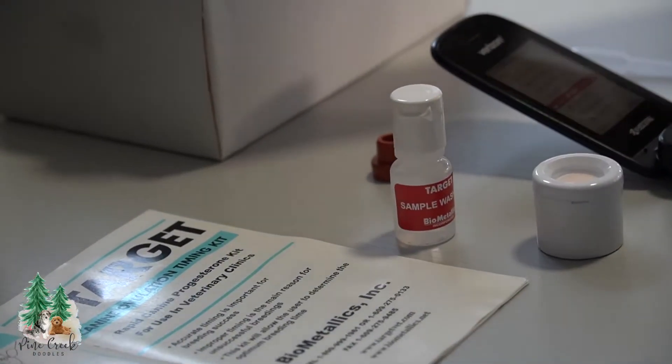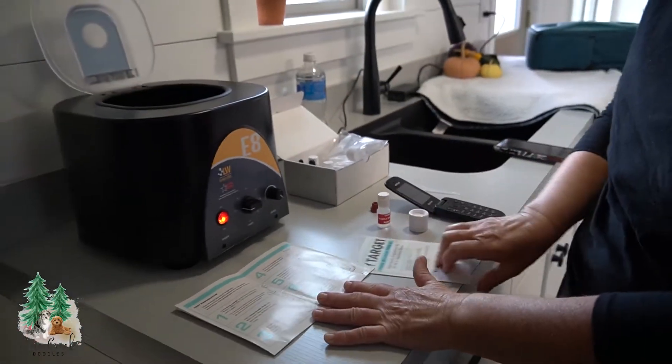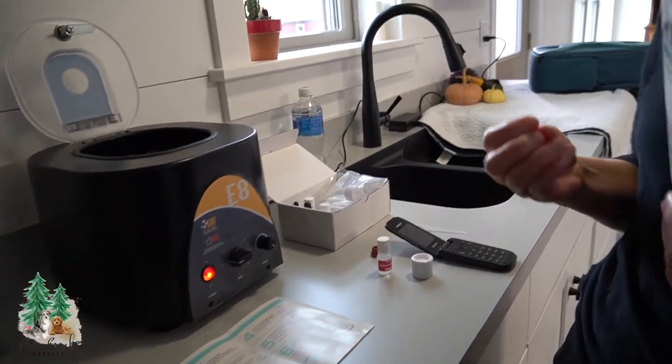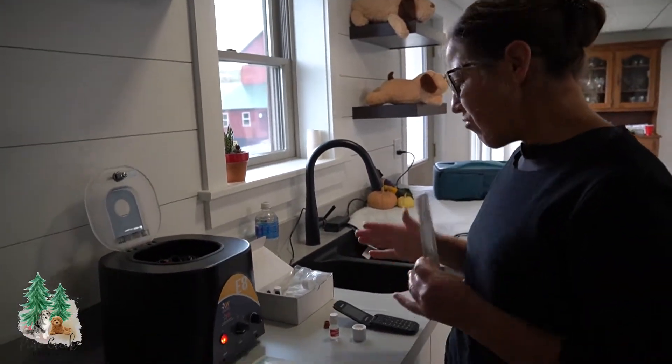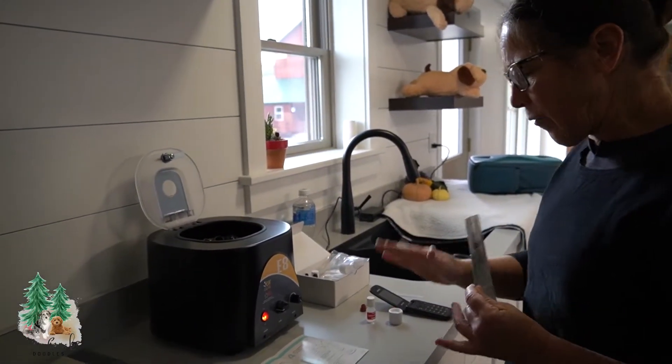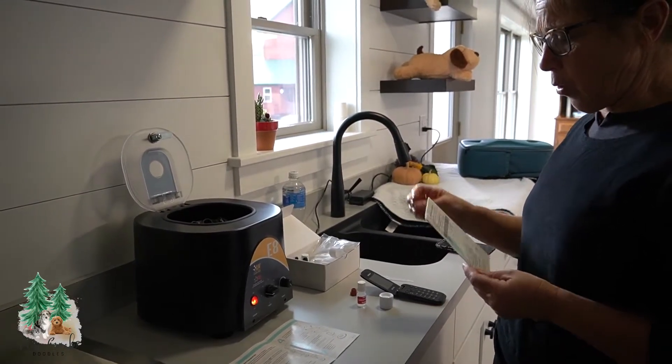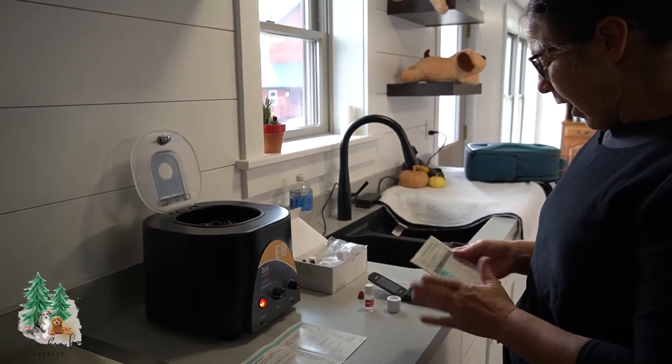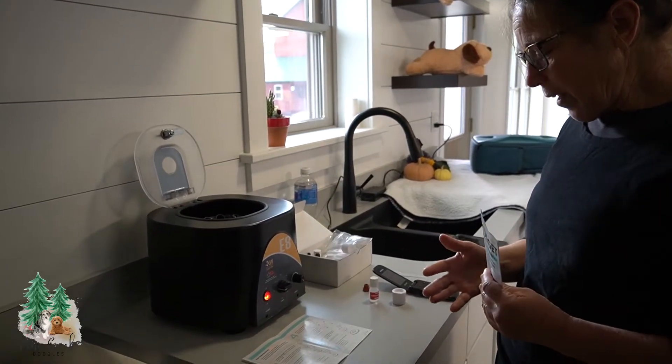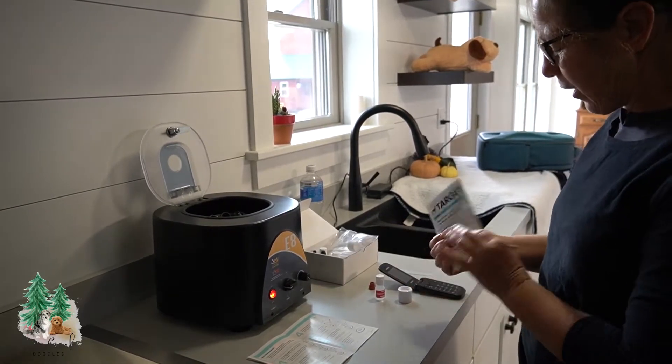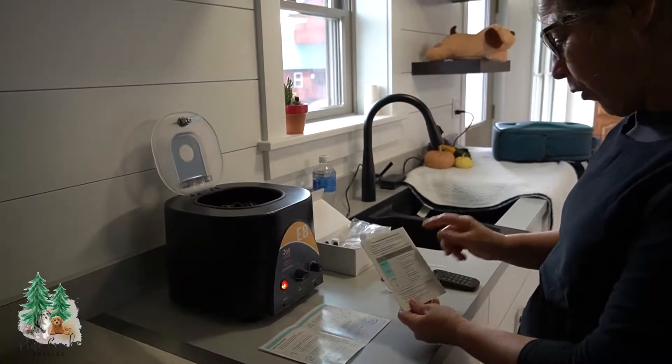And what this does is, it'll tell me how close my girl is and usually I wait until about day nine, eight or nine after I see the first sign of a heat and that is the female bleeding. So then we draw the blood at that time. We spin it and do our testing.